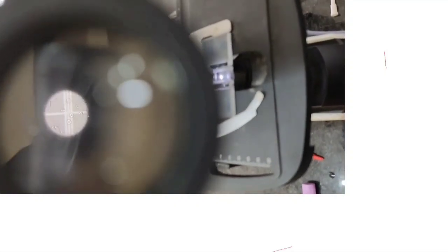See, I am focusing under the microscope. Yes, let's see how it looks. Yes, that's good. Yeah, that's one RBC counting area. So this is the one RBC counting area. We have to count 5 areas of this type.